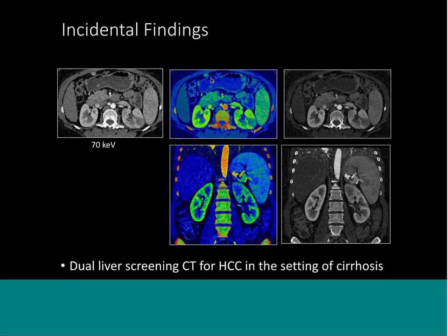This is a patient with an infection of that kidney. Left untreated, this patient could go to fever, leukocytosis, even sepsis. We wouldn't have a cause. And they'd have to come back to ED. White counts jumped, and now their infection has progressed more than it should have. We catch it here. We call and say, hey, there's no HCC. By the way, they have an infection. Can you put them on antibiotics? Outpatient treatment done. Okay, so we're helping the patient in many ways by doing this.